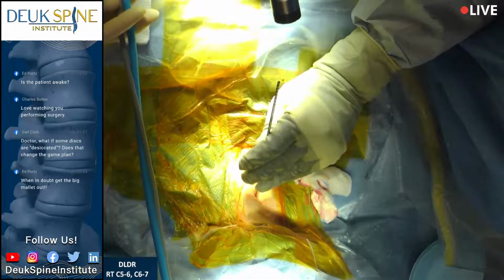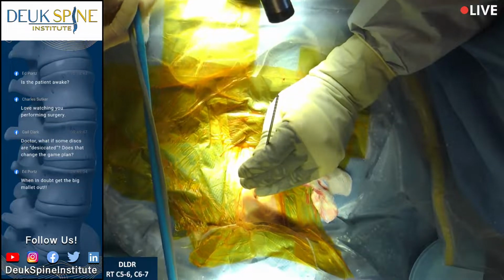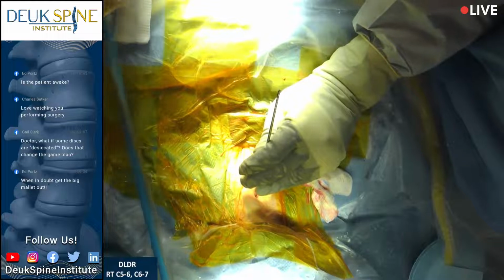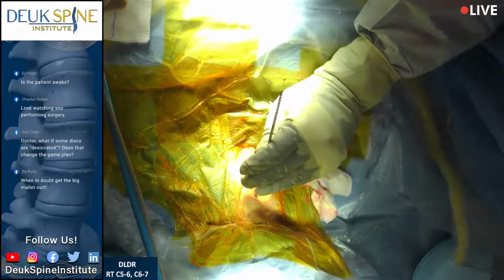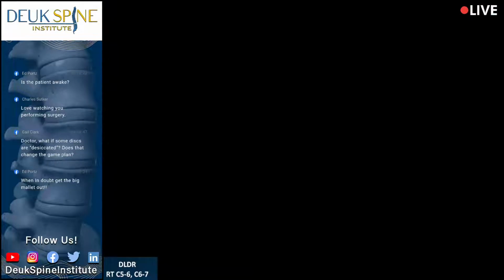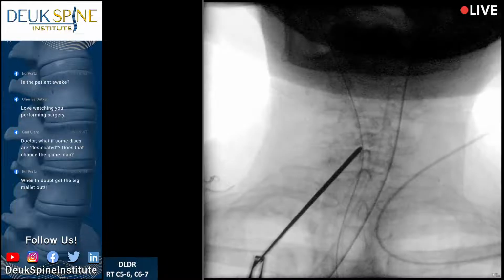Shot. Perfect. Shot. There we go. Let's just do another AP just to make sure. Sometimes your dilator can slip. I need a slight extension, so it would be like pull and extend. Perfect. Looks great. Back to a lateral.